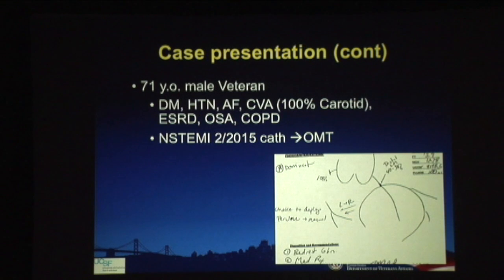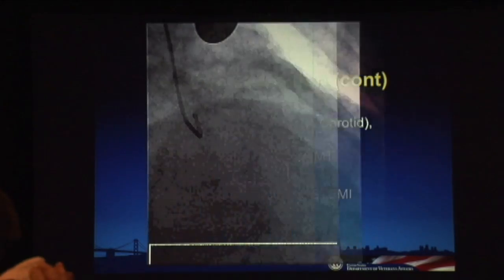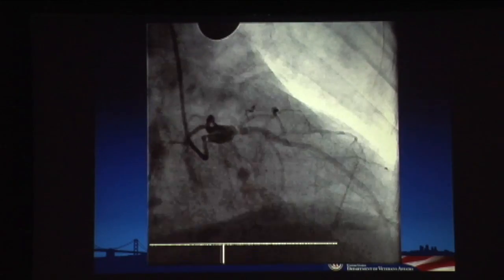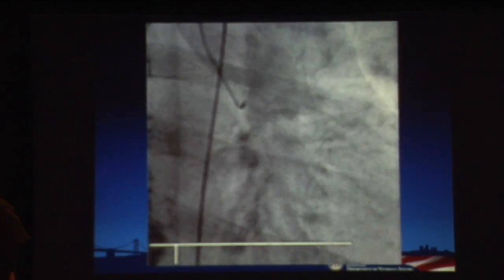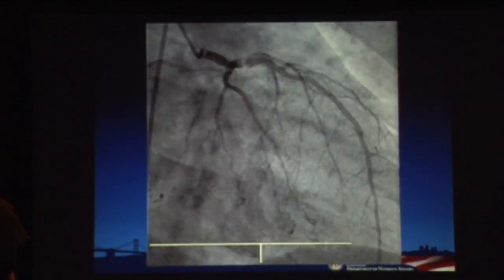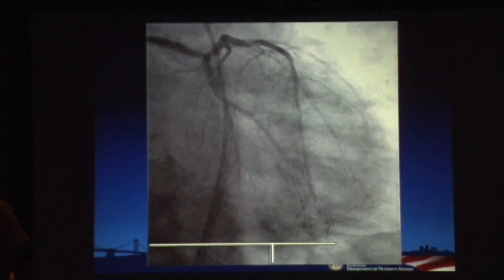So he went back to where he lives, and 8 months later, he had another non-STEMI. He had recurrent symptoms, similar crescendo angina, and he came back to the cath lab again. So on the follow-up cath, very, very similar, but on some of the views it looked like it was easier to say that that was truly a shelf in the left main, particularly these last.